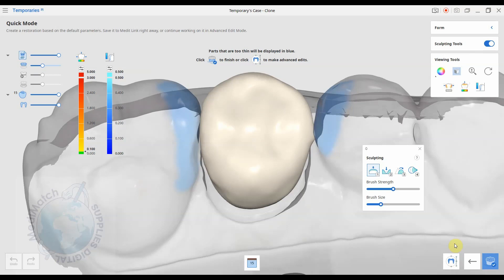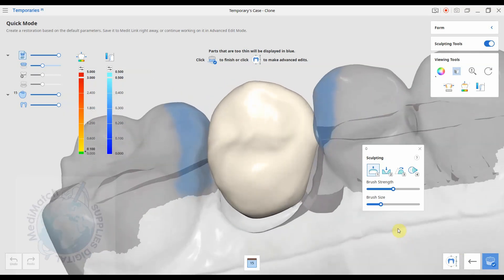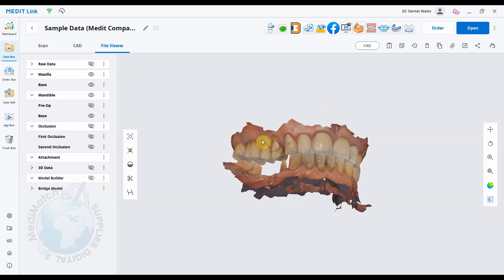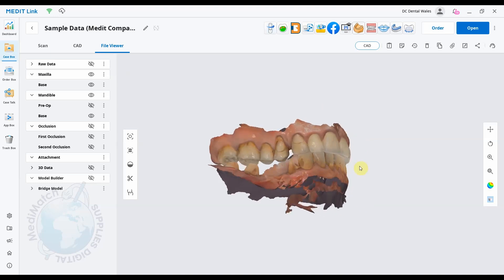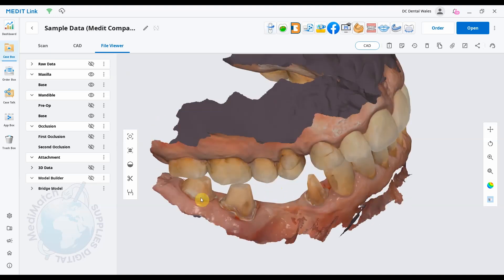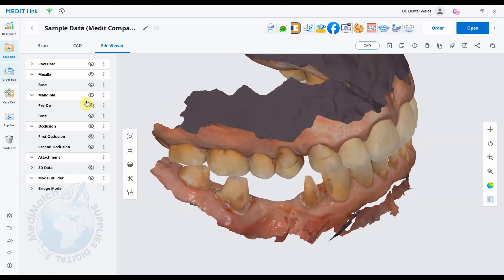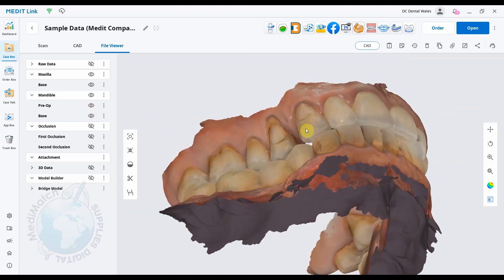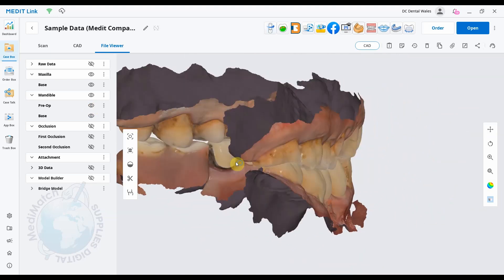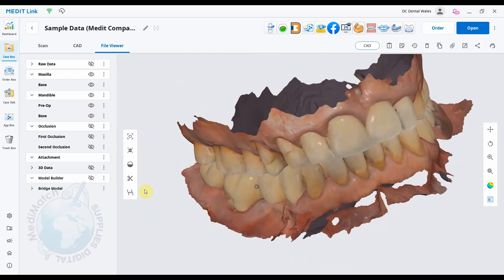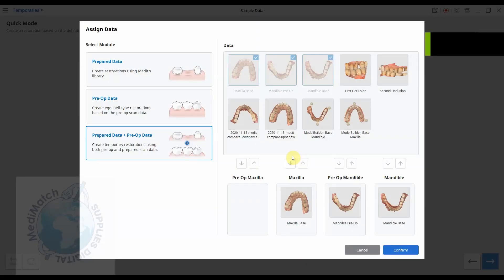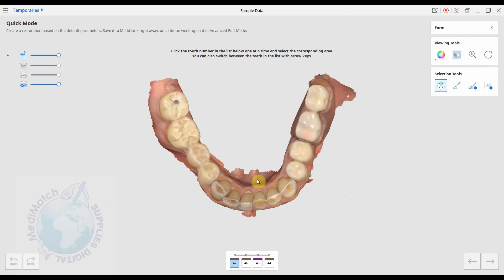Okay, we're just gonna have a quick look at a bridge now using the new feature in the temps app. So here we have some sample data with some preps and a space for a pontic, and we've also got the pre-op scan data as well. So the pre-op is just the old bridge in place. Okay, so let's open this in the temps app. We're doing the third option where we use the pre-op data and the prep tooth data. You can see at the bottom here we've got each tooth numbered so we know which tooth we're working on.